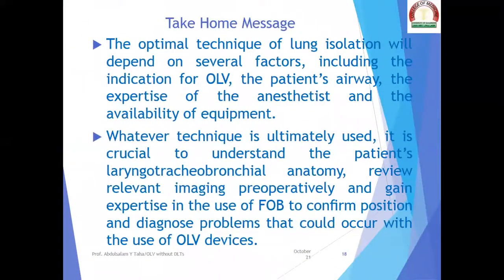So what are the take-home messages from our lecture? The optimal technique of lung isolation will depend on several factors, including the indication for one lung ventilation, the patient's airway, the expertise of the anesthetist, and the availability of equipment.